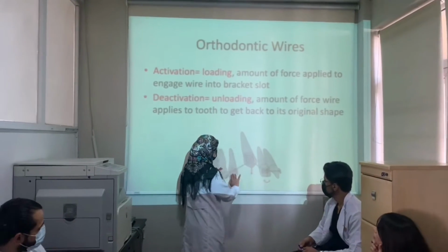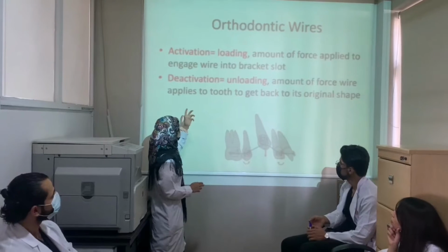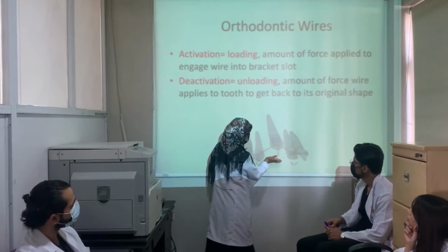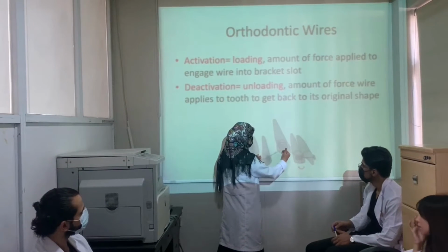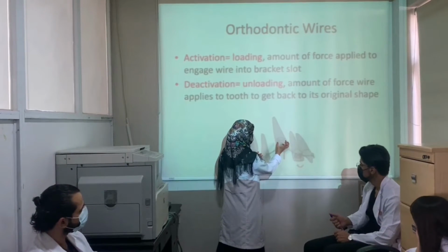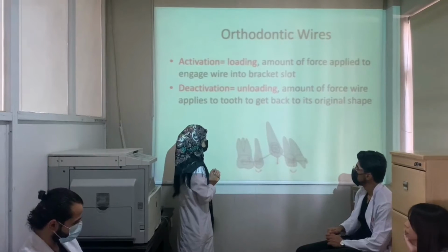Forcefully engage the wire because this is bending. And in the deactivation stage, which means unloading, the wire itself tries to straighten itself. When it wants to straighten itself, it moves the tooth with itself. It causes extrusive movement of the tooth, like this picture.